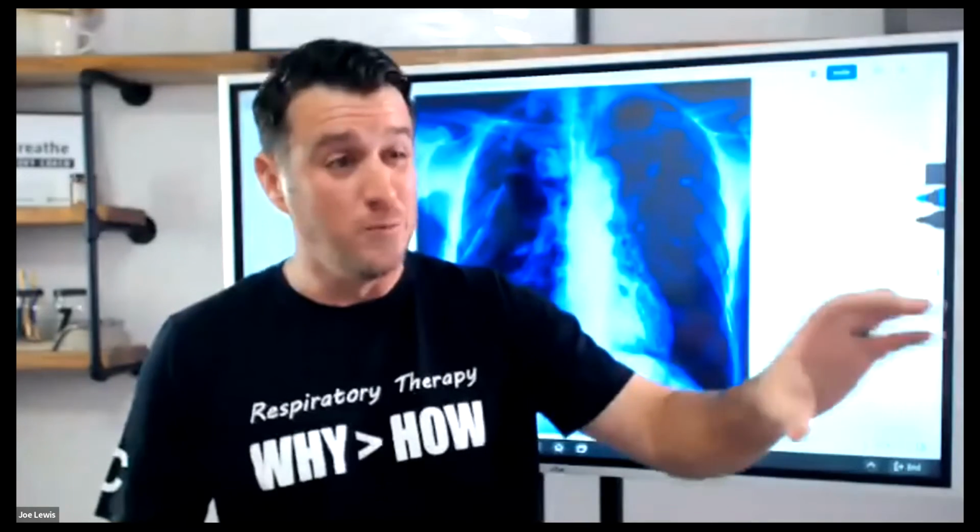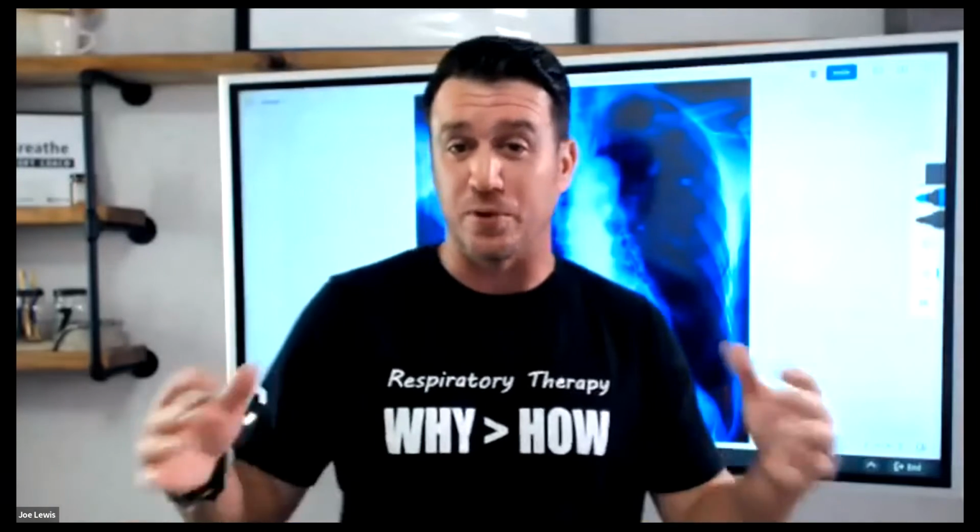Now, if you want to go one step further, we can talk about mechanical power. Mechanical power is another super big tool associated with reducing ventilator-induced lung injury. It's a super complicated formula, so complicated that they said, you know what? Nobody's going to do this formula at the bedside. So they've simplified it. They've actually come up with a simplified version of mechanical power that shows similar results.